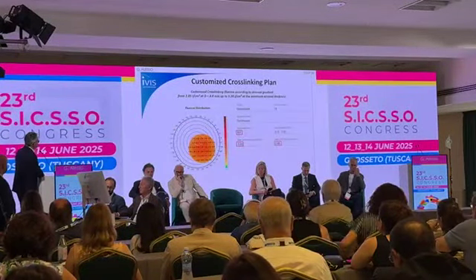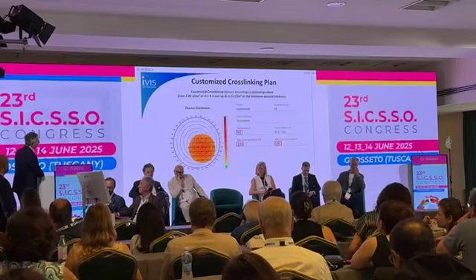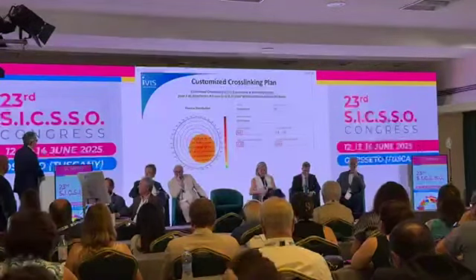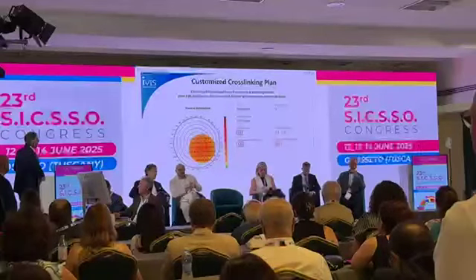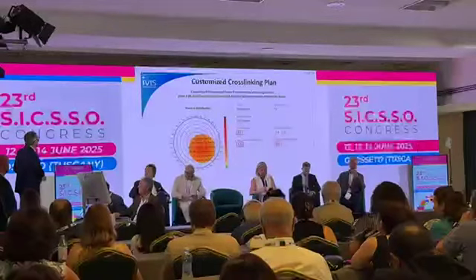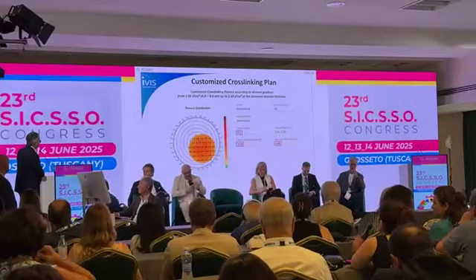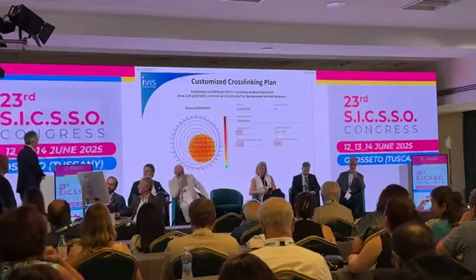Okay. And this is the cross-linking map. The energy will vary from 2.85 joules per square centimeter to 3.25 in the area of maximum bulging of this keratoconic patient.